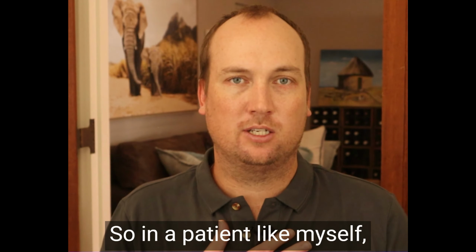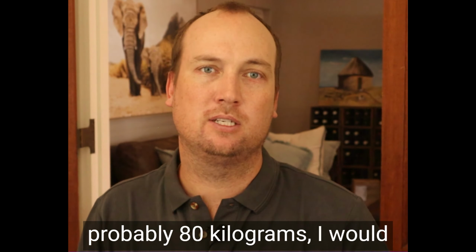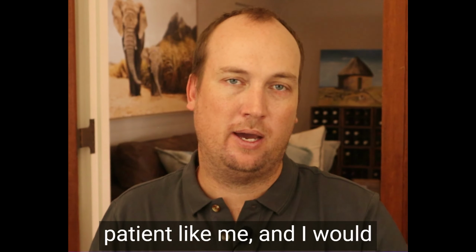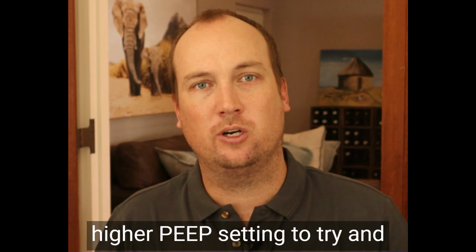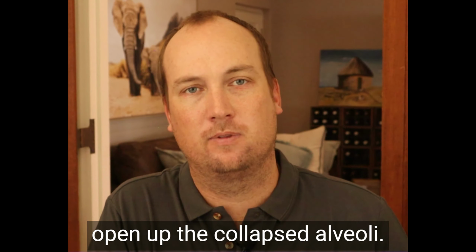So in a patient like myself, where my ideal body weight is probably 80 kilograms, I would deliver 800 mil breaths, and I would do 10 of those breaths at the higher PEEP setting to try and open up the collapsed alveoli.